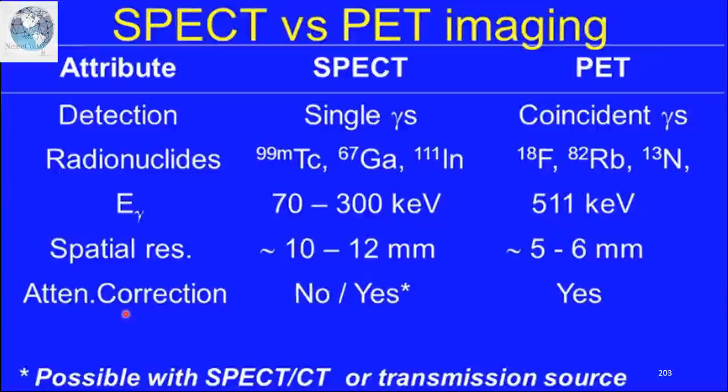Okay, jadi lesion, contohnya lung tumor yang kecil, about dalam 0.8 cm pun boleh detect clearly on the PET scan, but SPECT may be a bit blurry. Okay, so the image resolution, the sharpness of getting the spatial resolution is good on PET. And then we can do attenuation correction better on PET. But nowadays with SPECT, using a CT scan component, you can improve that as well.